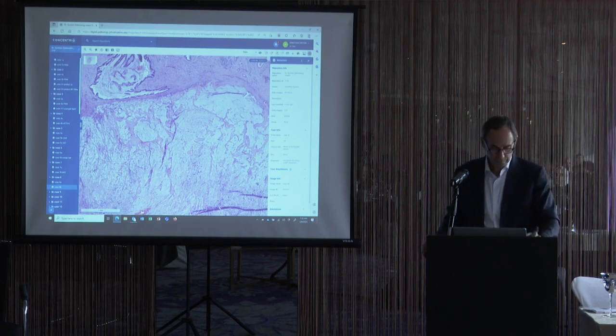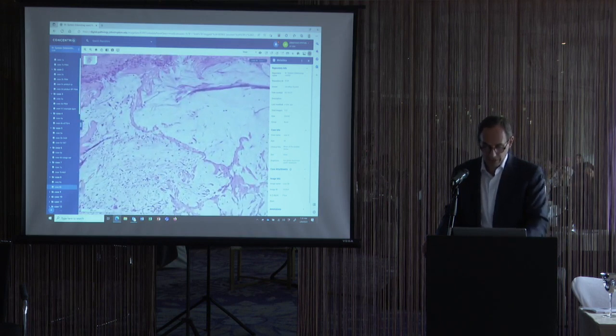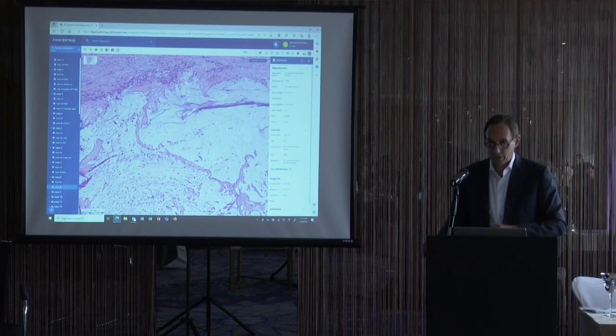And if you find epithelial cells within the extravasated mucin, does it make it malignant? Yeah, if I saw little signet ring cells floating in here or little strips of epithelium in this mucin, yes, that would be a mucinous adenocarcinoma.